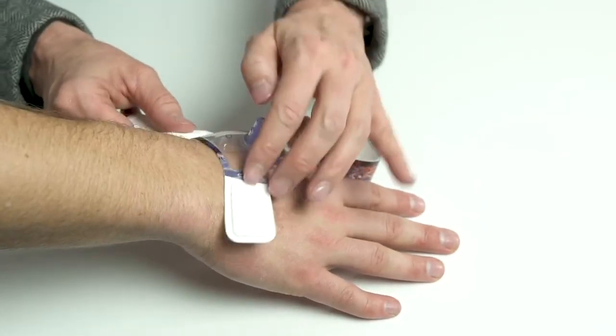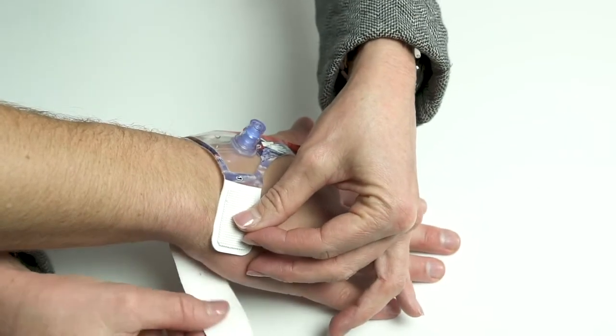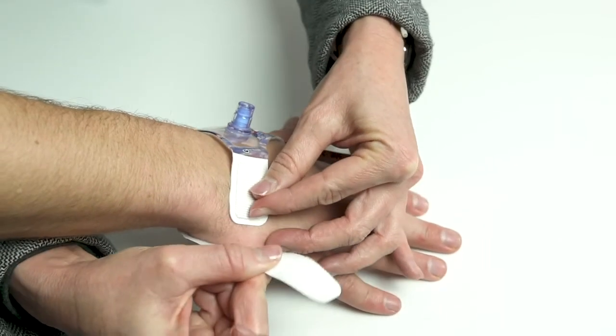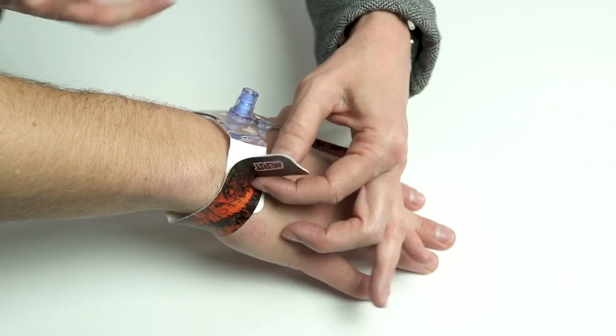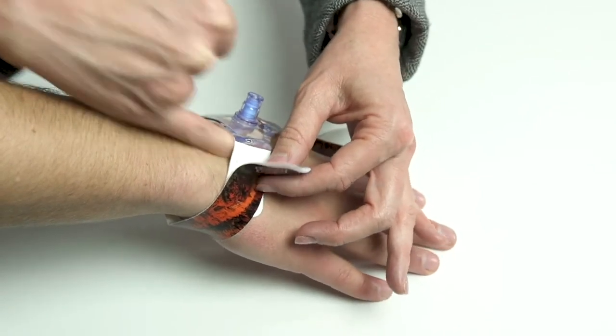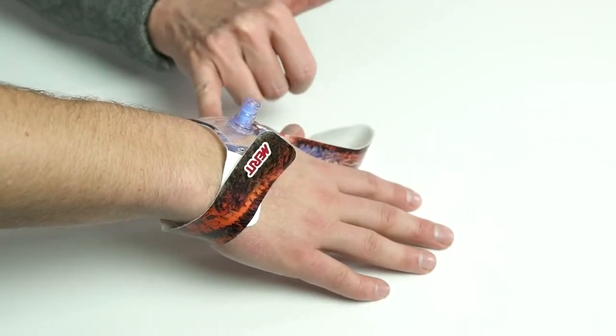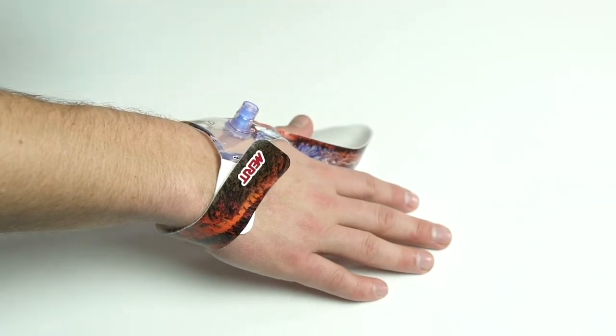They'll put it on and they'll hold here and pull this around and they'll pull it tight. But as they pull it tight, they don't support right here. And what happens is you get this gap where you can put a finger in there and then you get a lot of movement. And it'll happen on both sides of the backer plate.